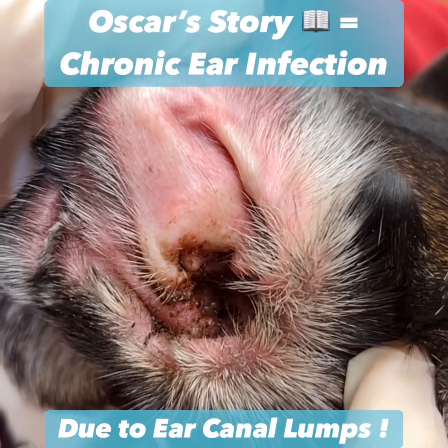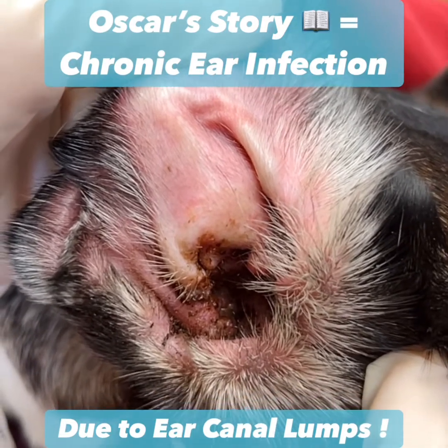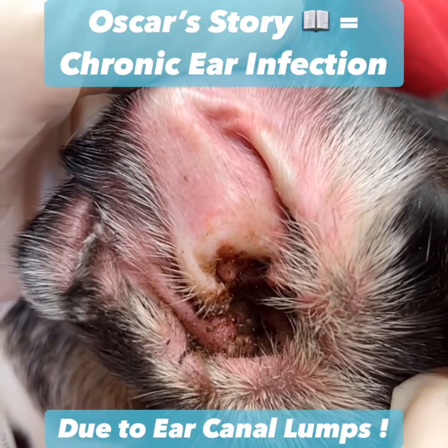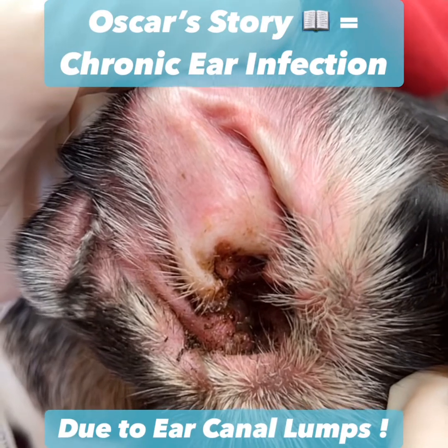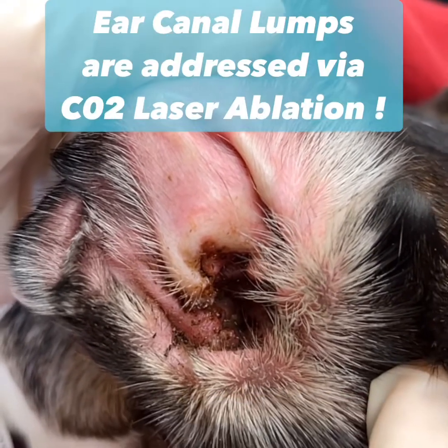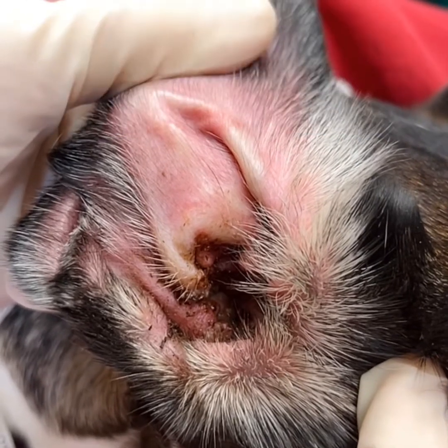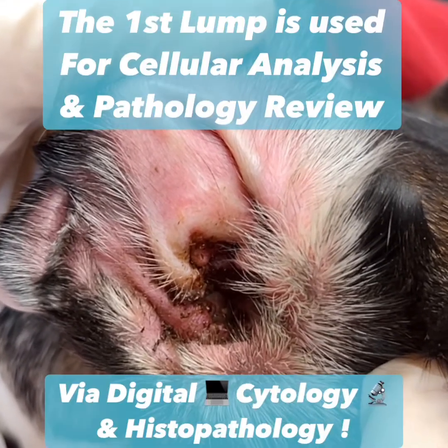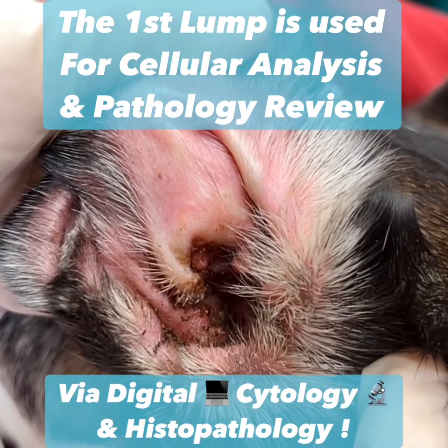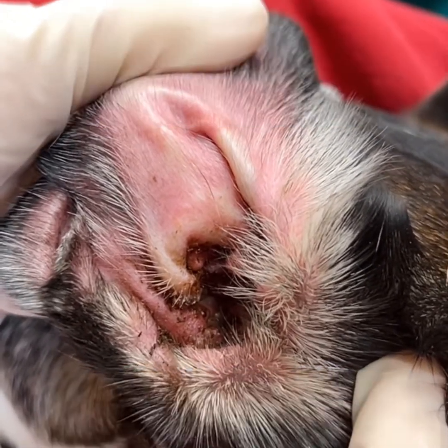Oscar's right ear is infected — it's red and swollen, and there are lumps in Oscar's ear that we are going to be treating with a surgical laser today. It's going to allow us to enter the ear canal. Keep in mind we are going to submit these lumps for digital cytology to help us get an idea of what they are, and also of course to histopathology once we remove them.